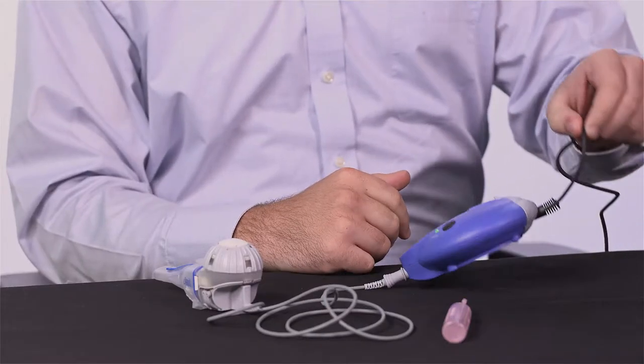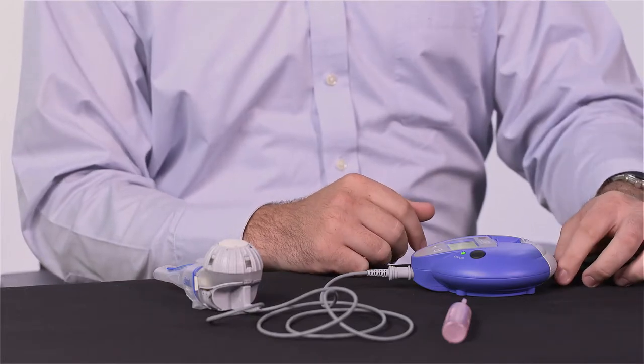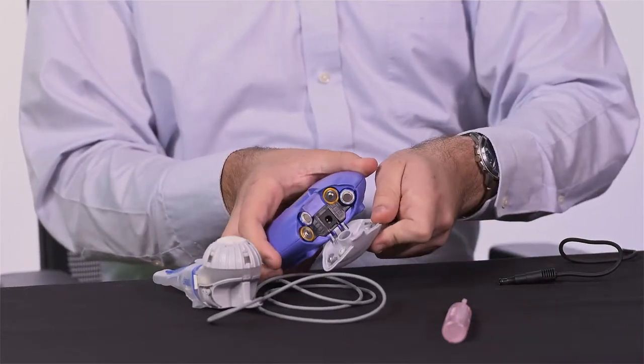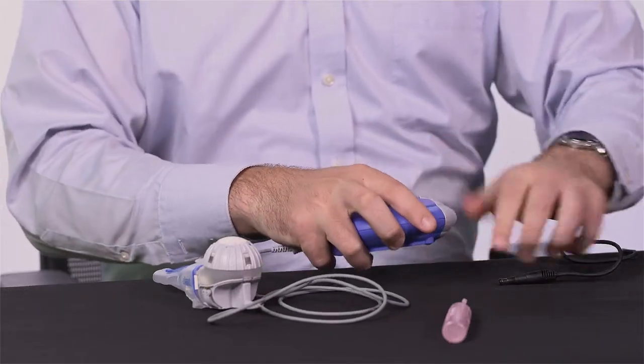The eTrack nebulizer comes with a power adapter, but can also be powered by four AA batteries. We recommend that you have additional batteries with you at all times, especially if you are traveling.